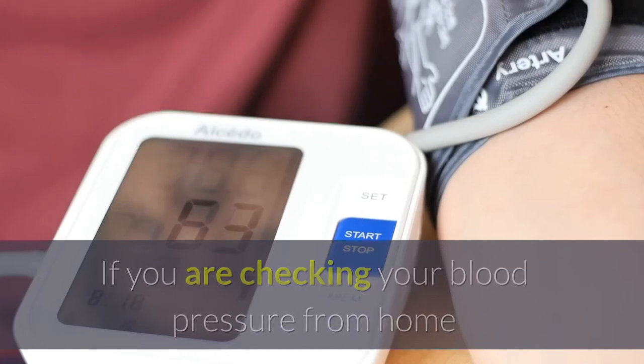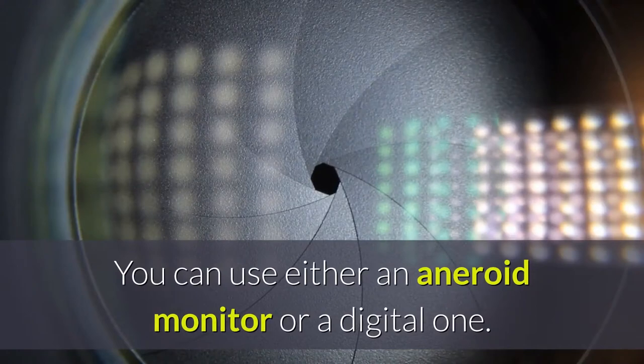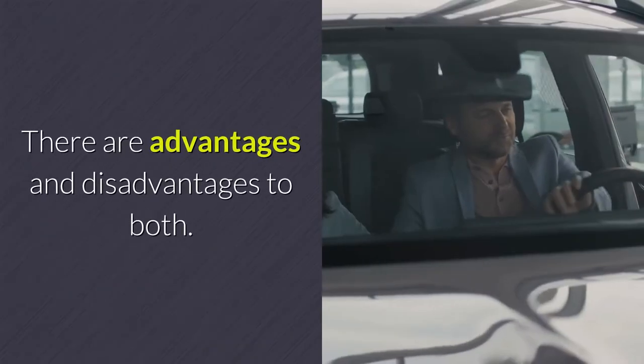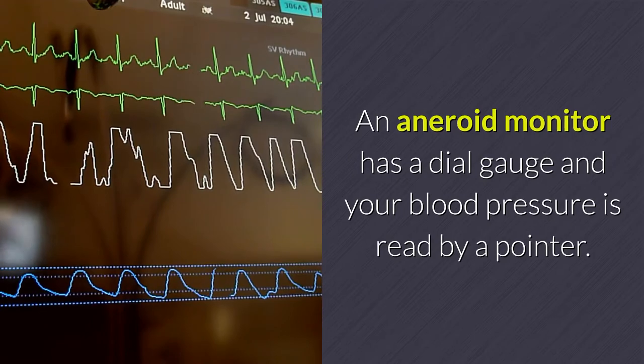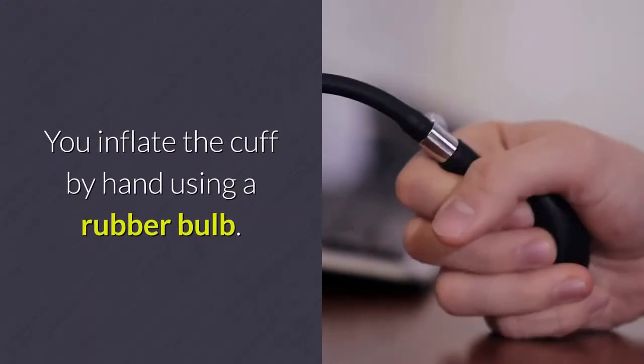If you are checking your blood pressure from home, you have the choice of choosing your own monitor. You can use either an aneroid monitor or a digital one. There are advantages and disadvantages to both. An aneroid monitor has a dial gauge and your blood pressure is read by a pointer. You inflate the cuff by hand using a rubber bulb.